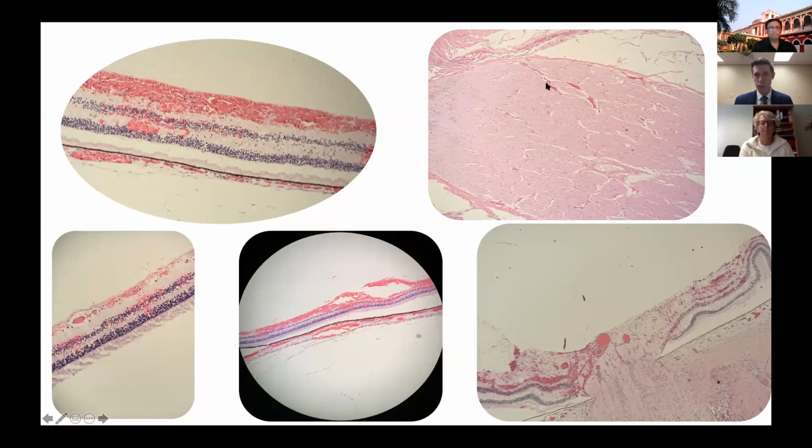And then this one's interesting because you see hemorrhage tracking actually into the nerve. So this is the optic nerve tissue, and there's hemorrhage right there. And then you can see that demonstrated as well on this slide at the very bottom right-hand portion of your screen, tracking around the peripapillary margin. And they also have a little retinal detachment too.